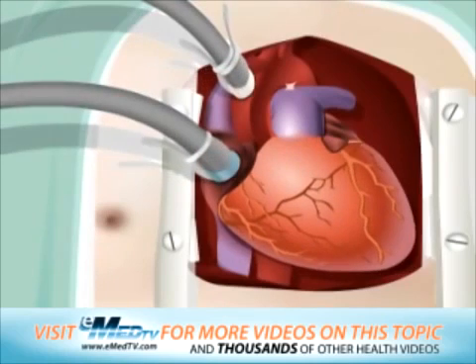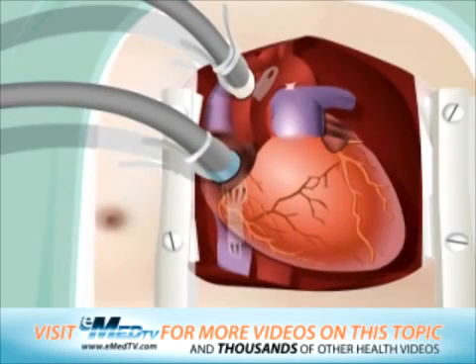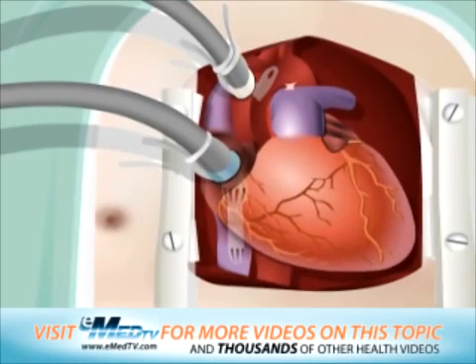The surgeon will then connect the heart to the heart-lung bypass machine with a plastic tube. Blood from the heart is then sent to the bypass machine through this tube. The machine supplies the blood with oxygen and then pumps it back to the rest of the body.